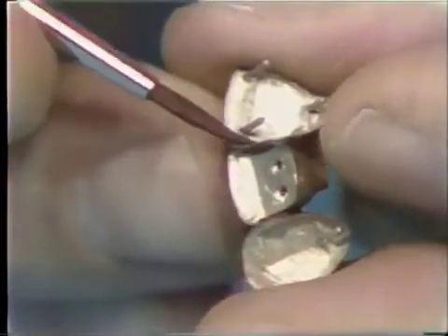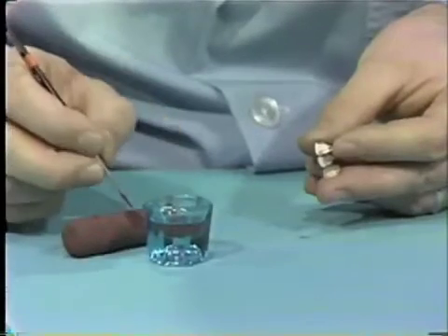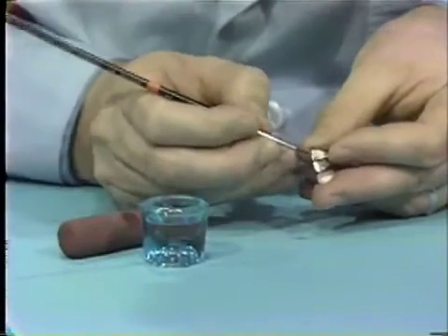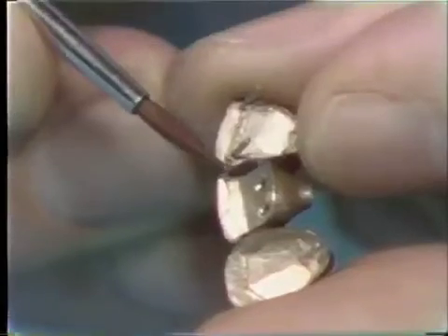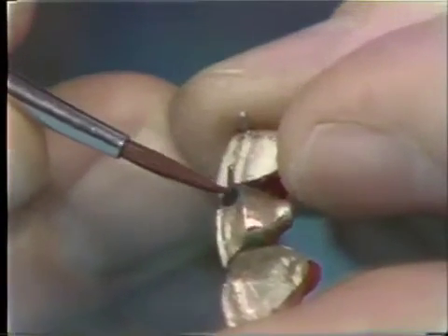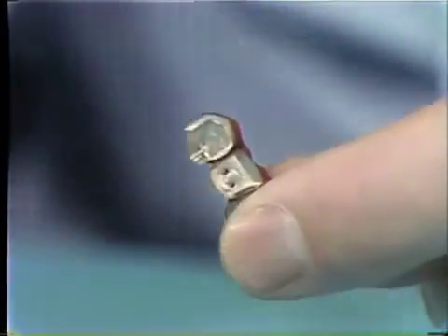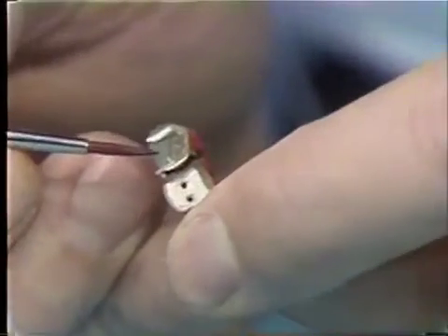A narrow strip of antiflux is placed inside the pontic casting and on the distal finishing line on the internal portion of the pin facing, taking care not to get antiflux on the external portion of the casting, and a small amount on the mesial groove of the cuspid.